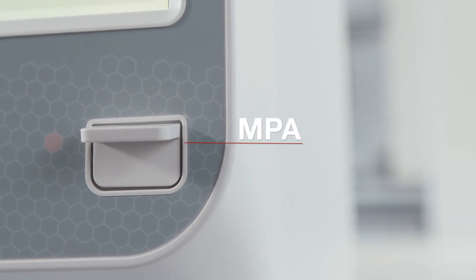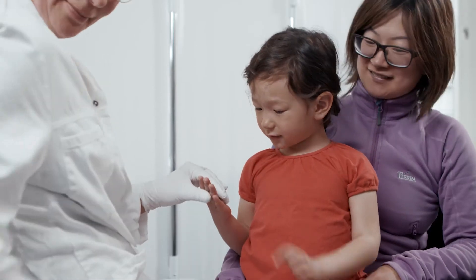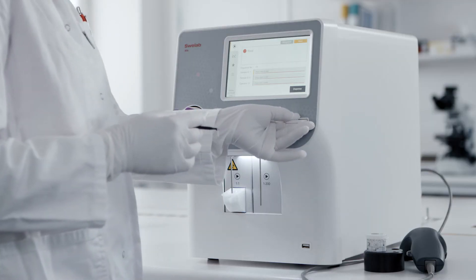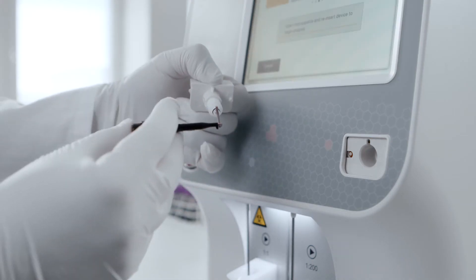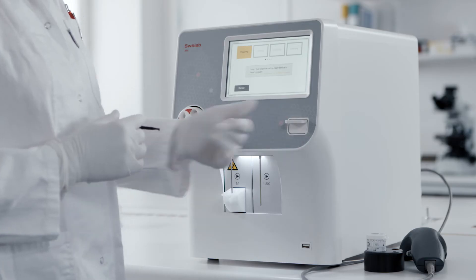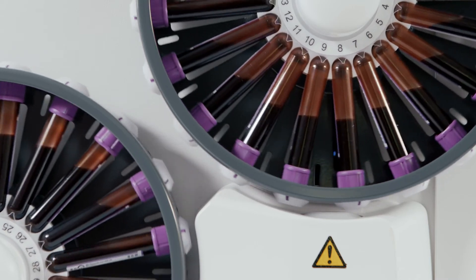Moreover, Swelab Alfa Plus offers the MPA — a unique micro pipette adapter — where users introduce a drop of capillary blood directly into the unit. This means an entire CBC plus three-part diff from just 20 microliters of blood.